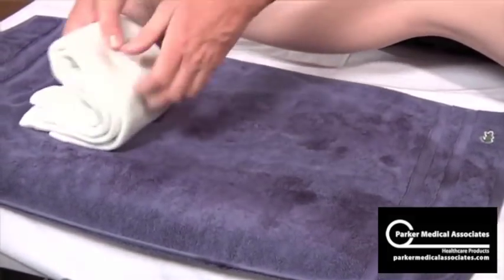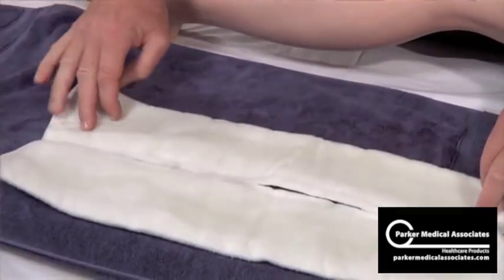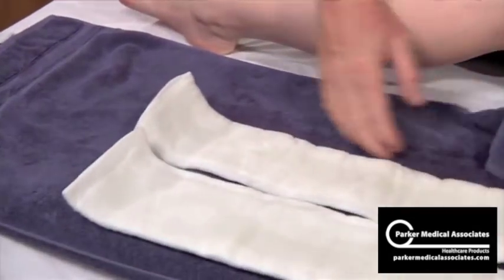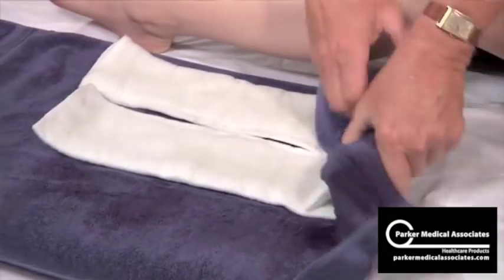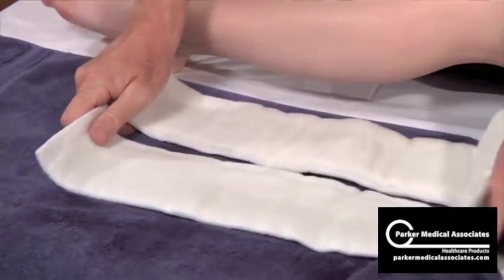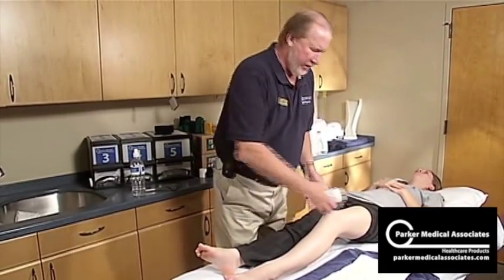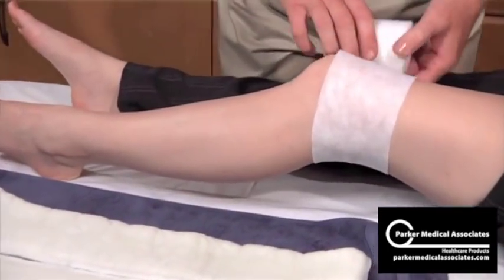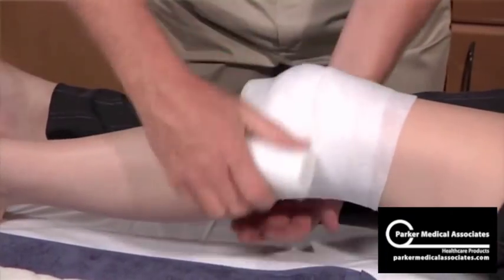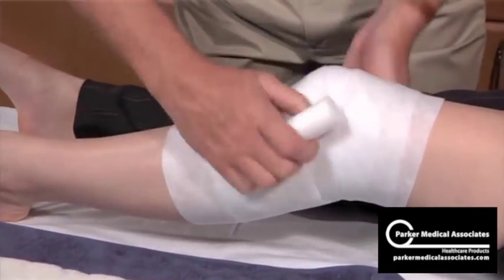Sandwich this, then just fold, fold, lean on it, push that water through. Open it back up to a single layer, whirl it down your towel, squeeze. Now use the dry side of the towel and do that a second time. If you have any abrasions, you can always pad the knee. Put your dressing on if you need and just lock it in with some dressing — just add more comfort to the patient.